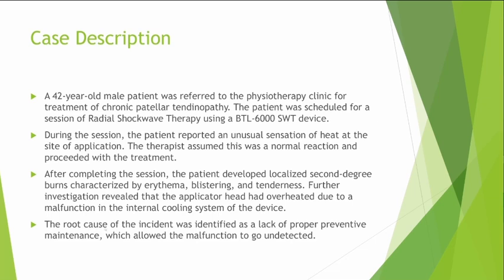So, the root cause of the incident was identified as a lack of proper preventive maintenance, which allowed the malfunction to go undetected. Okay, so it's very clear. Let me just repeat it real quick. The patient just went to the physiotherapy. He wanted treatment for chronic patellar tendinopathy, and the device used to treat him was the radial shockwave therapy.